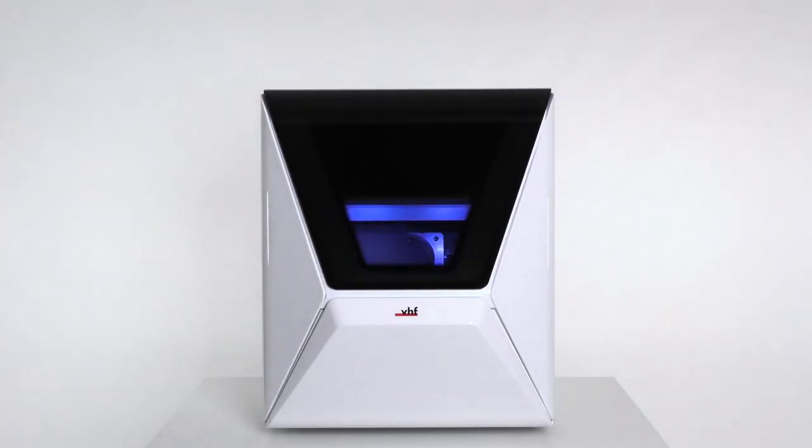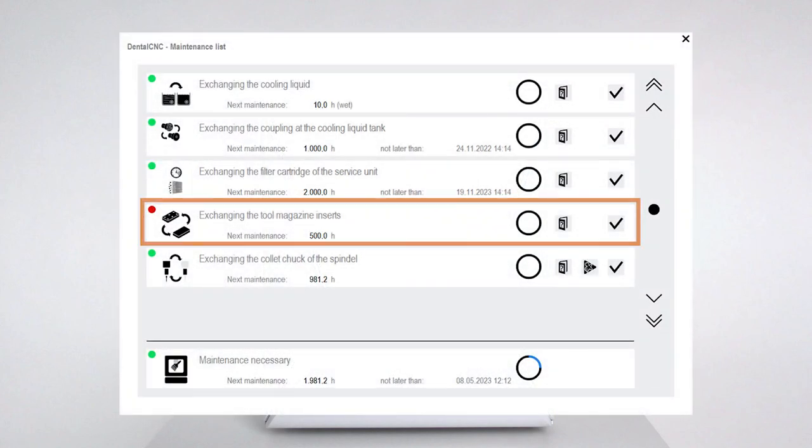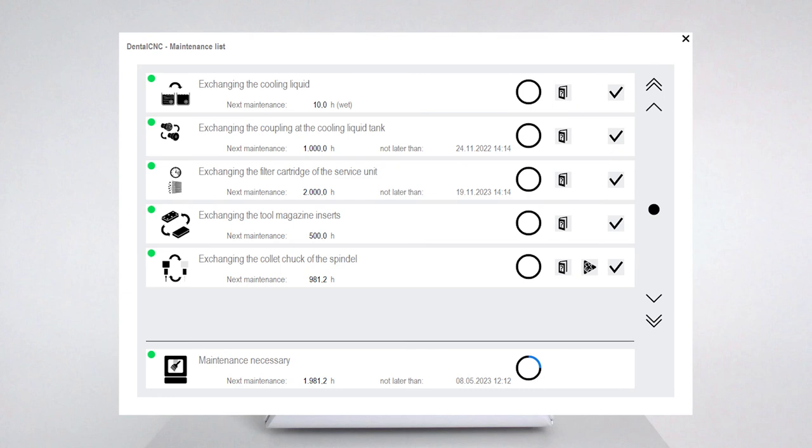Once you have finished replacing the tool magazine insert, mark the corresponding task as complete in the maintenance section of Dental CNC. This will keep your list up to date. For a comprehensive knowledge base about VHF dental machines and dental CAM, visit dentalportal.info.